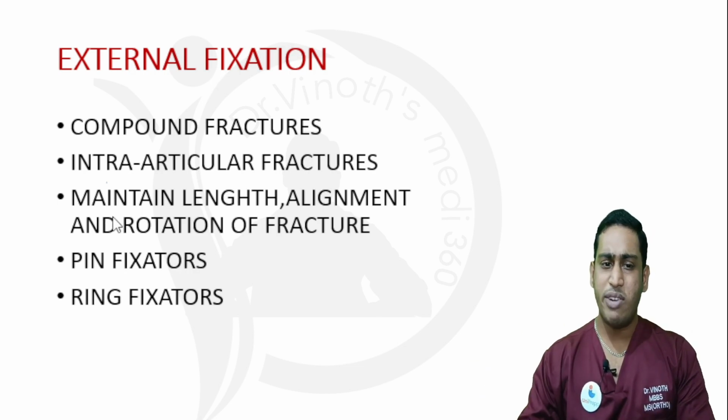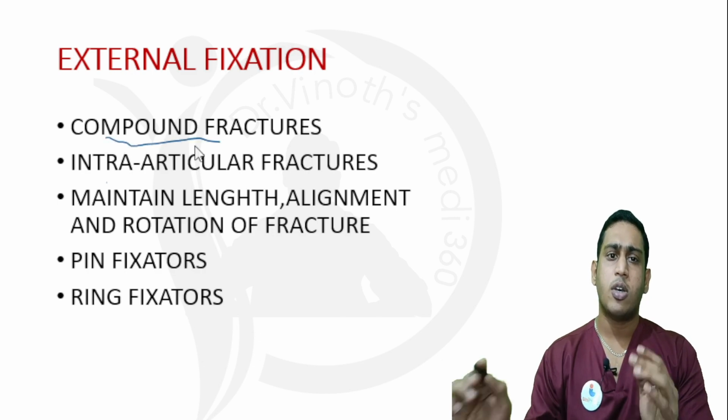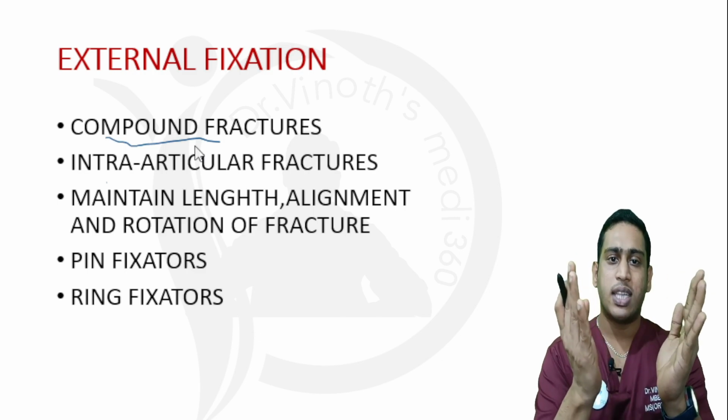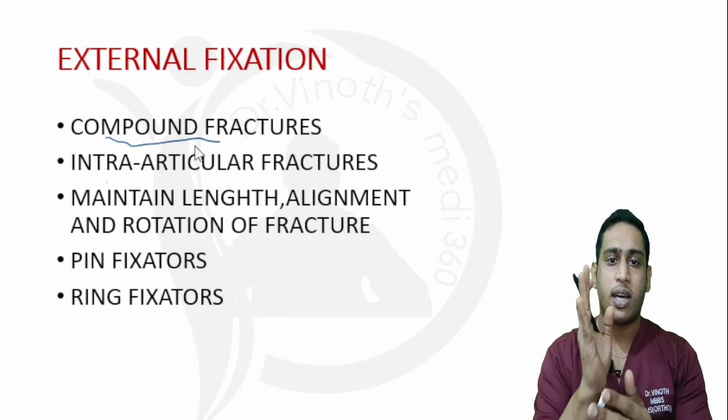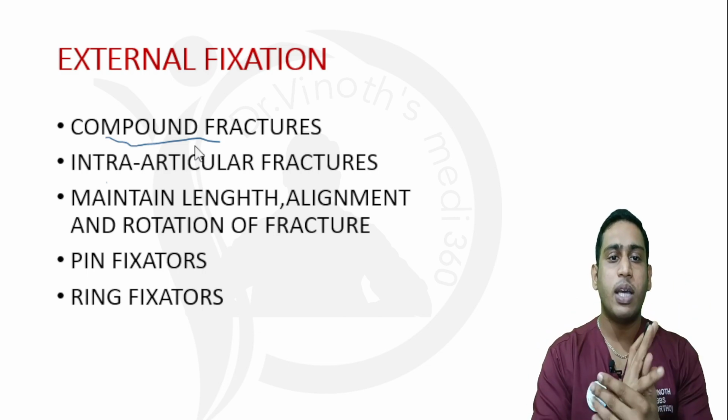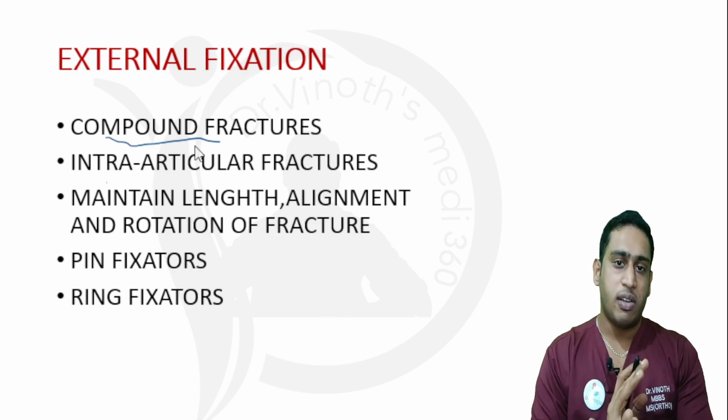So when will we be applying an external fixator? For compound fractures or open fractures. Because whenever there is an open fracture, we know that there is a wound at the fracture site. So when we apply a plate or nail, there is a chance that there might be an infection or osteomyelitis in the near future. So it will be better to apply an external fixator.